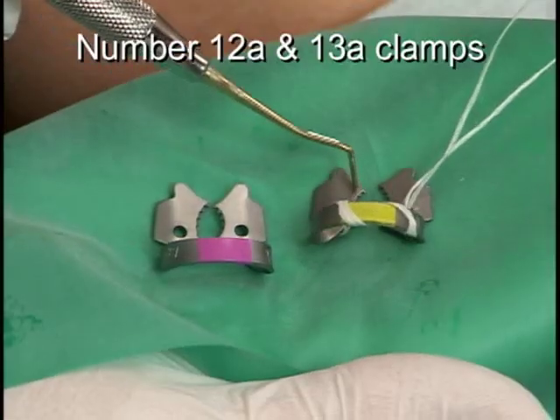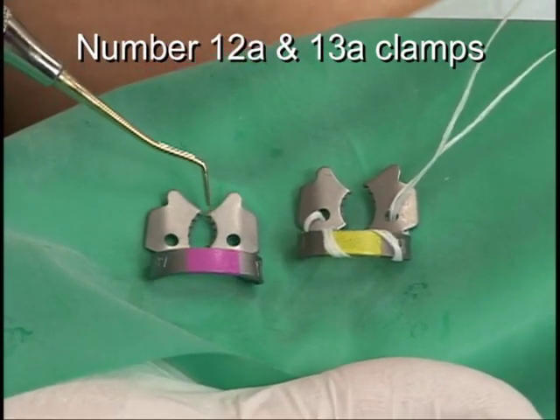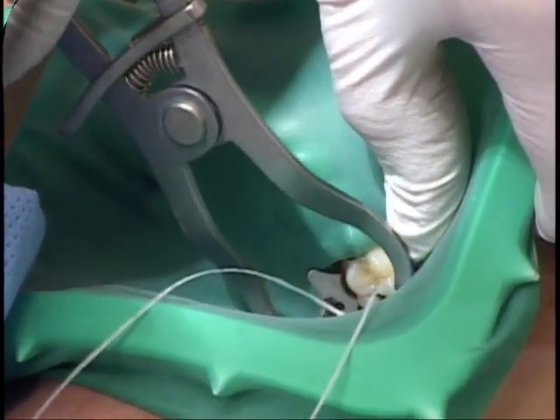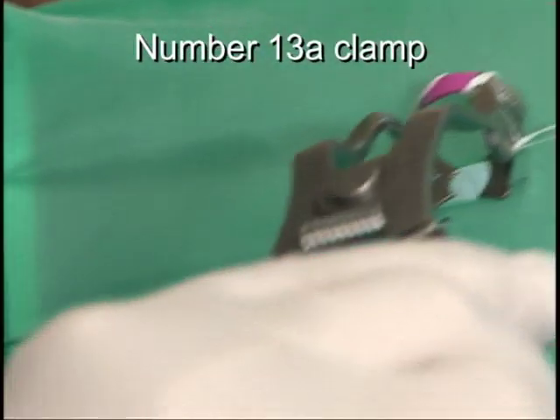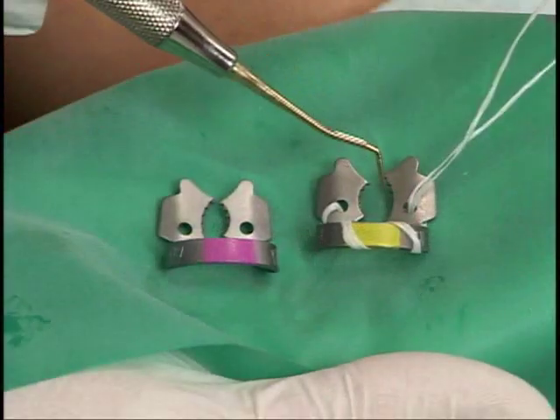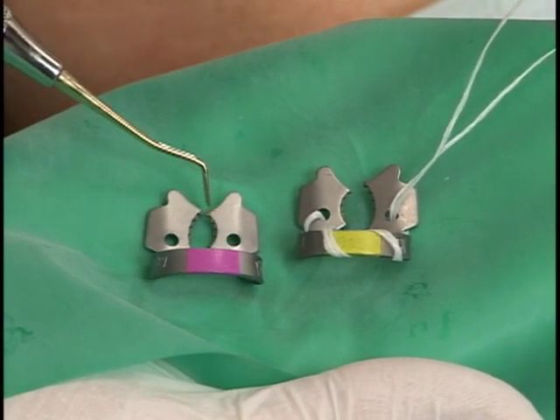Best suited for molars, the number 12A and 13A are a paired set of clamps, meaning they are designed with offset jaws. The wider jaw is placed on the buccal aspect of the tooth. The number 12A is used on the lower right and upper left, while the number 13A is used on the lower left and upper right. The serrations on the jaws of these clamps provide better retention, particularly for structurally compromised teeth.